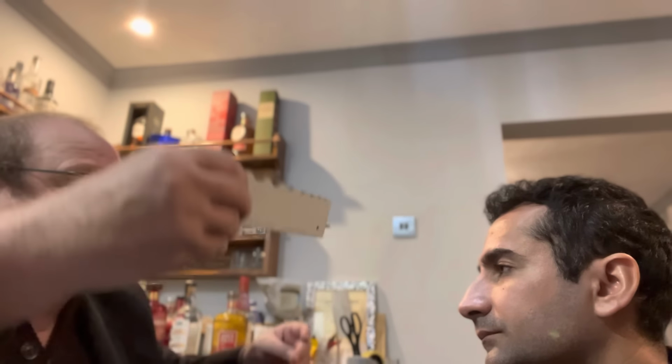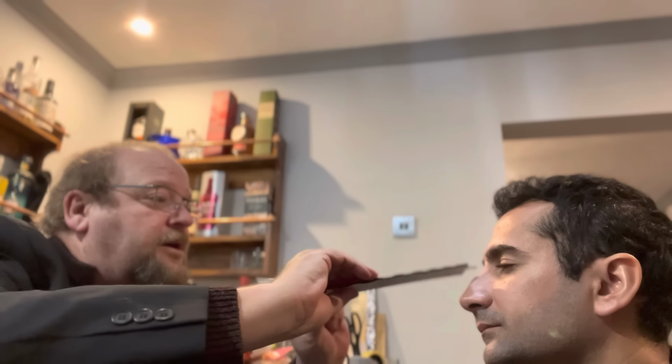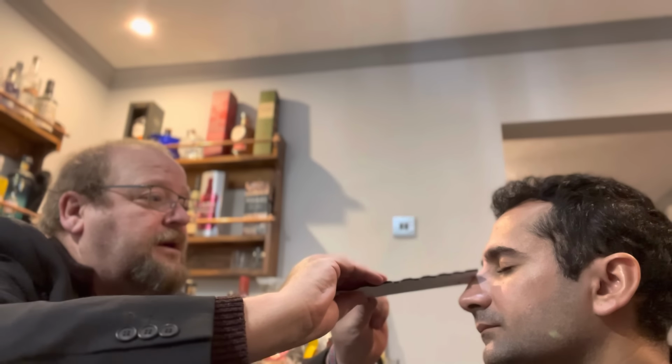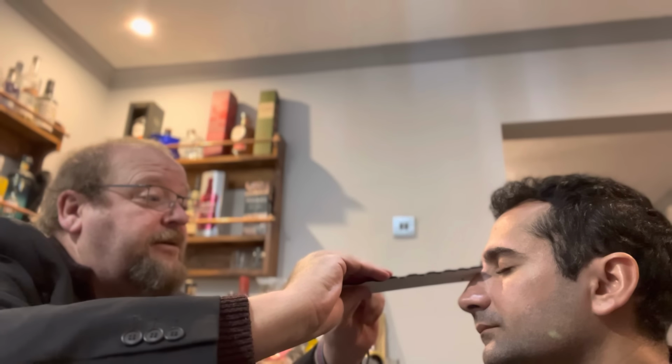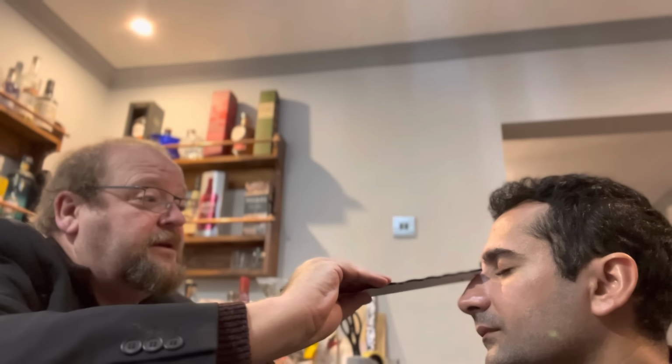The next measurement I'm going to do is called the splay angle. For the splay angle, what I'll need to do is put this onto your nose. I angle it down about 10 degrees and just keep your eyes shut for a moment. And I'm just projecting this towards the corner. Normally you'd do it there, but as you can see now as I do that, it's just catching your eyelids. So right, we've got that now.